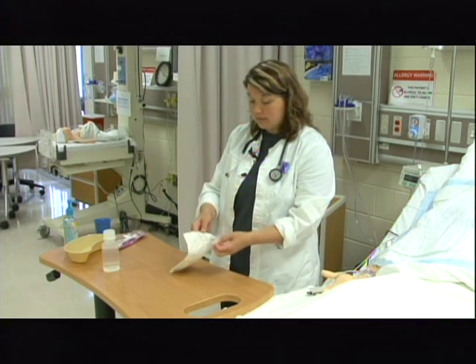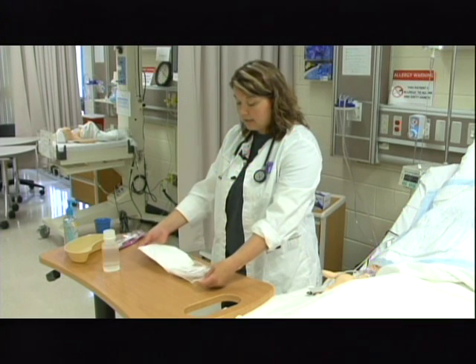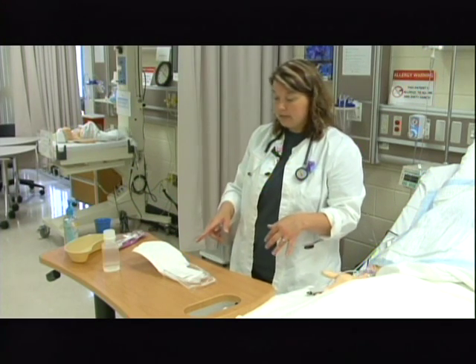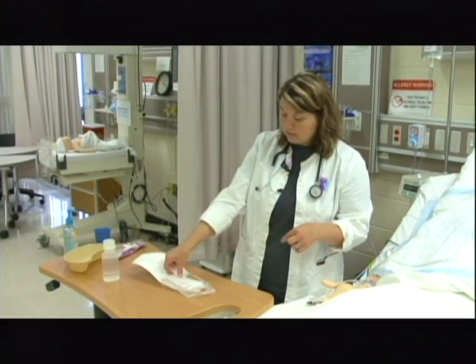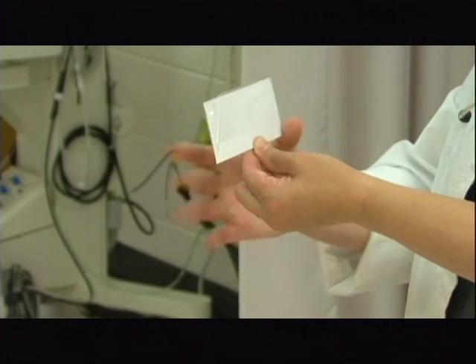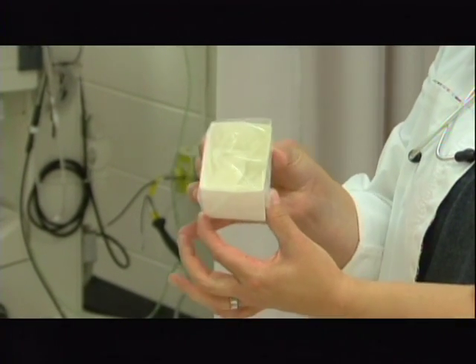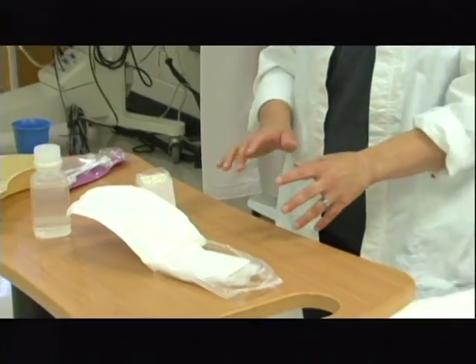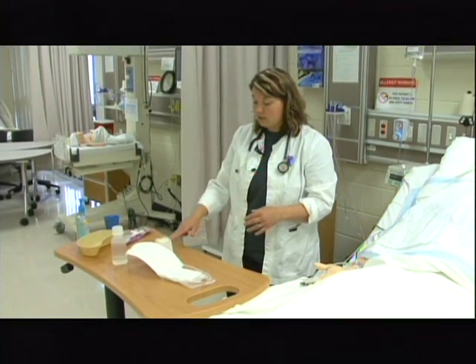I've already established that my table is clean and dry. I'm going to open this up by peeling it back without touching anything inside the kit. I need to get out the container that holds the sterile solution without touching anything else. On this container there is a plastic piece and paper at the bottom — keep your fingers on the bottom as you expand it. When it opens up, the plastic is on the inside. Set this off to the side; open it away from your sterile field, then set it down. The outside of the package is not sterile but the inside is.